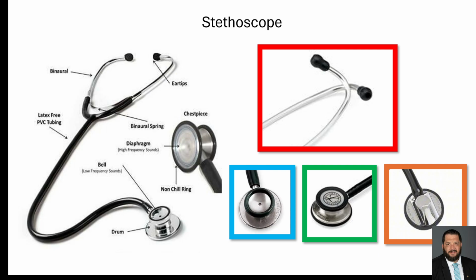And when we talk about the stethoscope, this is a precision tool and it has specific uses and is designed with intention in mind. Okay. So let's take a look at the stethoscope and see the parts here. So first you have the ear tips. These can be solid plastic or soft rubber or latex. These go into the provider's ears for you to be able to listen. If you notice, they are curved. This curvature is designed to follow the ear canal, and the stethoscope, when placed in the provider's ear, should be curved facing toward the front of your face.